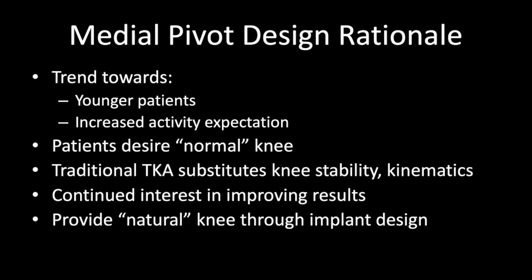Next, I would like to talk a little bit about the concept of the medial pivot design. There's a trend towards younger patients with increased activity expectations, and patients desire a more normal feeling knee. The traditional total knee arthroplasty substitutes knee stability and kinematics instead of attempting to reproduce stability and kinematics of the native knee. So there remains continued interest in improving the results of total knee arthroplasty and to provide a more natural knee through implant design.